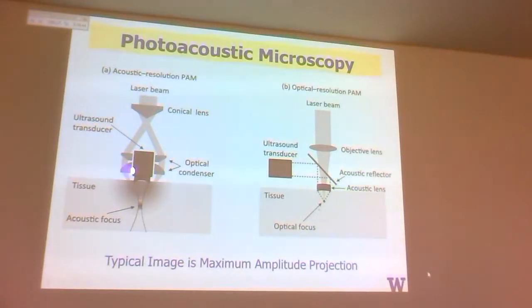And you're working at fairly high ultrasound frequencies, typically 50 to 100 megahertz. And this allows you to look at depths up to a few millimeters with resolutions of about 25 micron or so. All right? And really, this is just kind of moving the frequencies up in a traditional photoacoustic approach. And so it's fine, as I said.